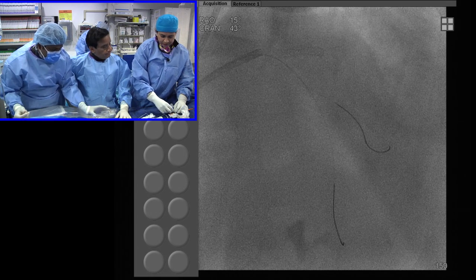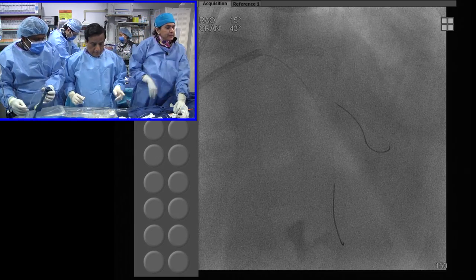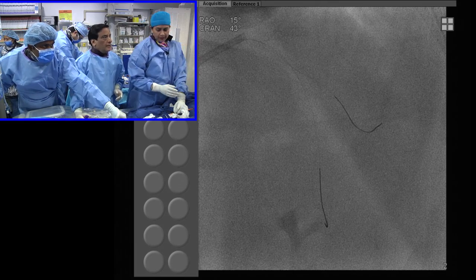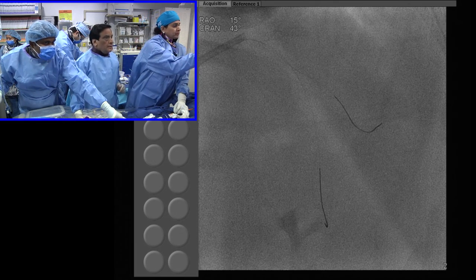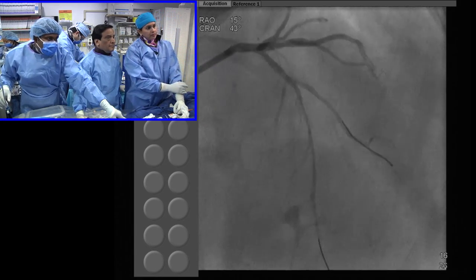No. Yeah. The question comes is, let's take a last picture. We are not taking a picture now. No, it's okay. Don't take a picture. Go back to that one. Good. What should be the strategy now? I think that's the key.